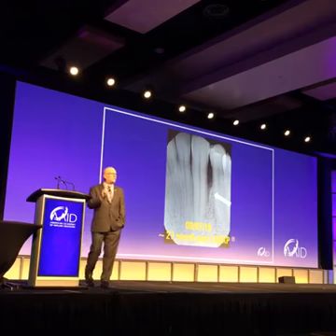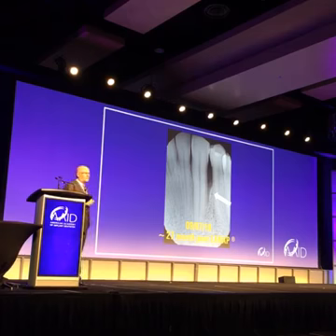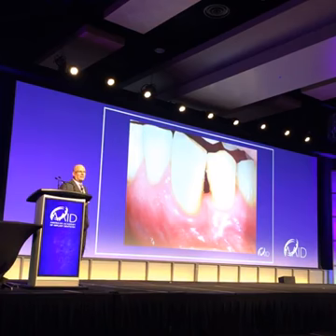Again, 1 treatment. 20 months later, and 27 months later, it still heals. Until you get a functional lamina dura, that bone will still come back. And the patient's only coming in for 3-month maintenance. I did not retreat this case. That's pretty good. Pretty happy with that case. And that's what the tissue looks like. If you saw that, you would not expect the patient had the 13 millimeter pocket in that area 2 years ago. Because we really didn't get any recession.